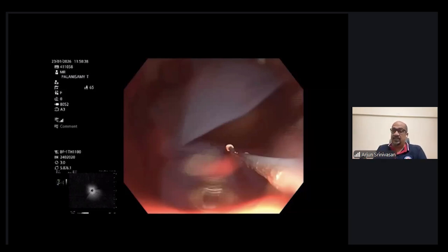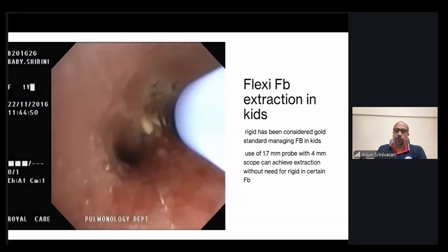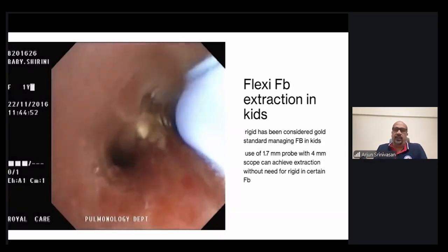Even if the patient has controlled ventilation, you're going to be losing sight of the place where you have taken the biopsy for a minimum of 12 to 15 seconds, which means that there can be a significant amount of bleed. Especially if you're doing it without a conduit, you're going to get into a lot of trouble if you have bleed.